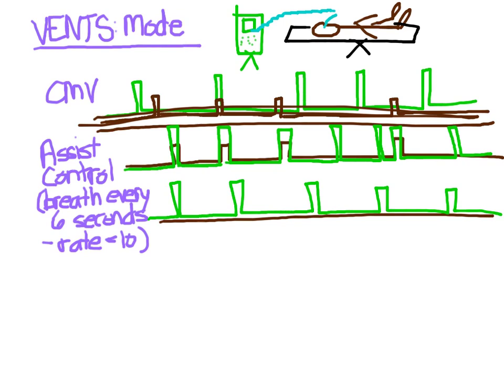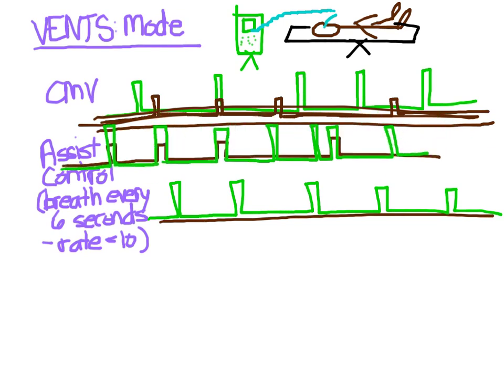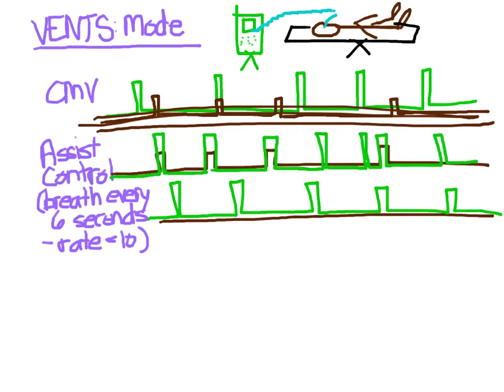Another thing that you might notice is that here the patient got 2 breaths right next to each other. That might be a lot more ventilation than we want. So let's say our patient is breathing similarly to up there, again.